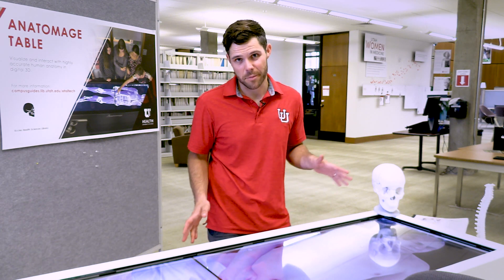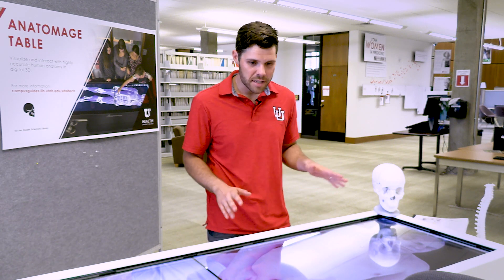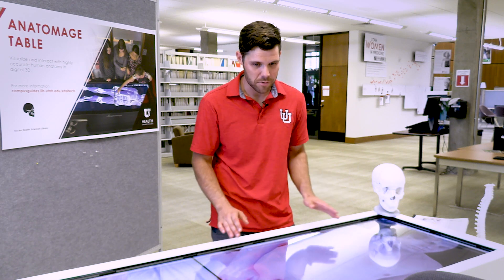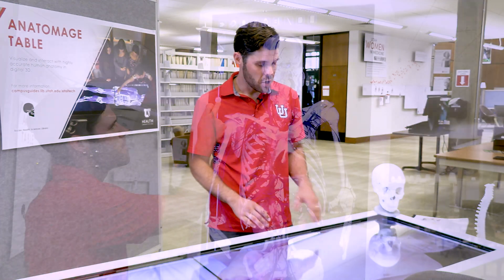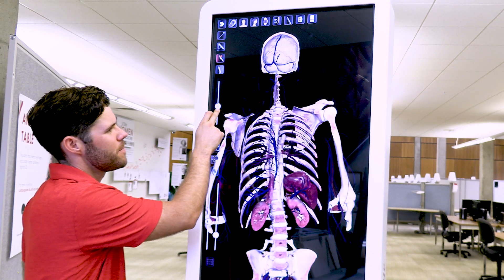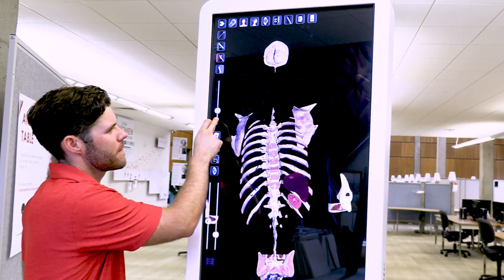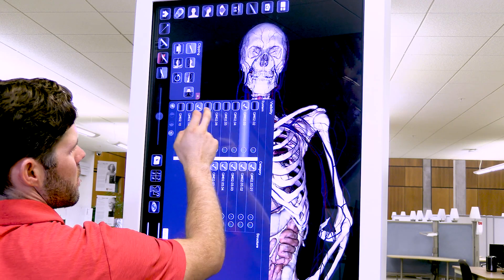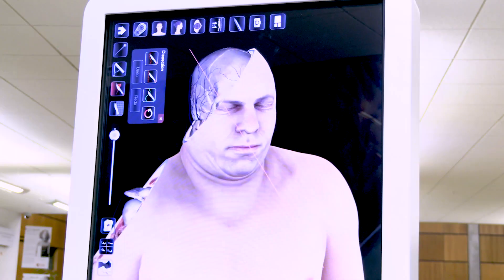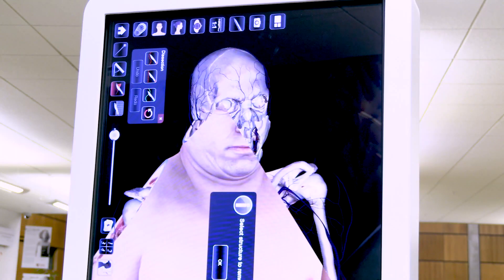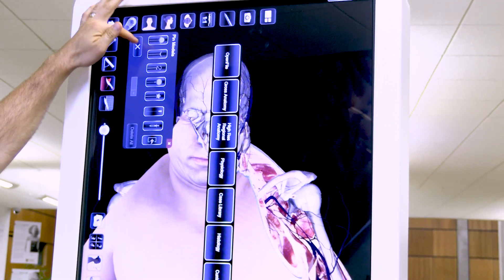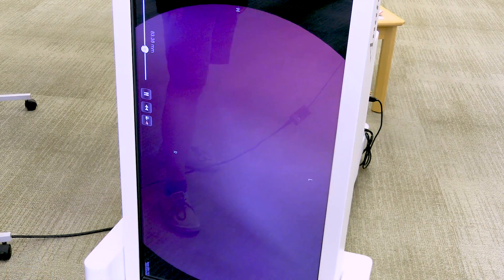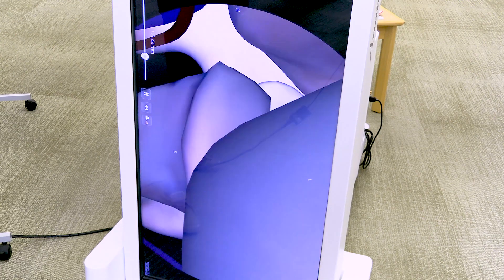With the Anatomage Table, you can virtually dissect full-scale images of actual humans and animals. You can remove layers to reveal bones, muscles, nerves, veins, and arteries. You can make incisions with digital tools and explore thousands of real medical cases. You can fly through internal anatomy to simulate endoscopic procedures.